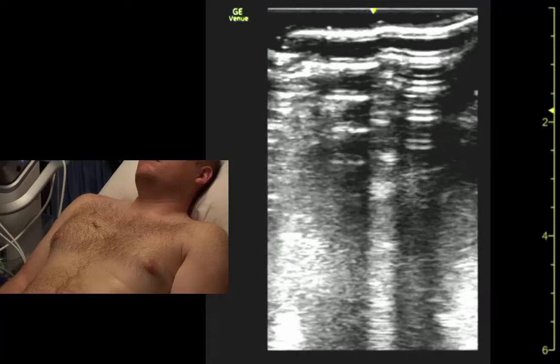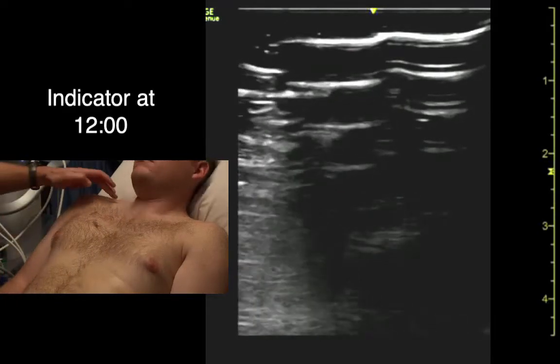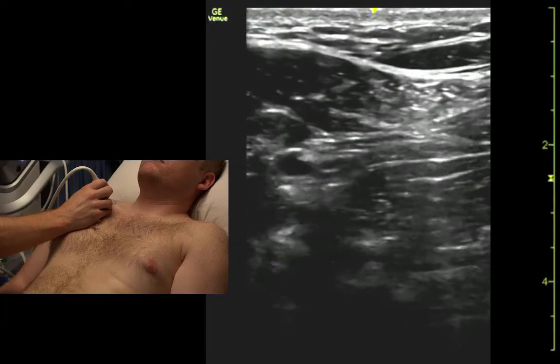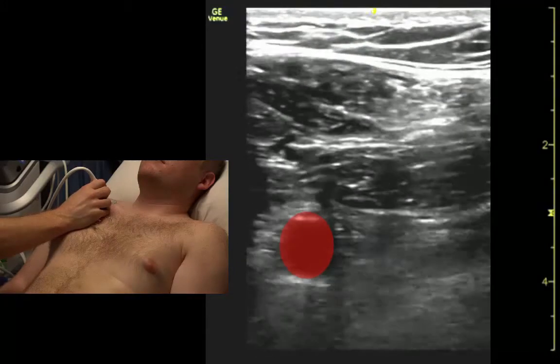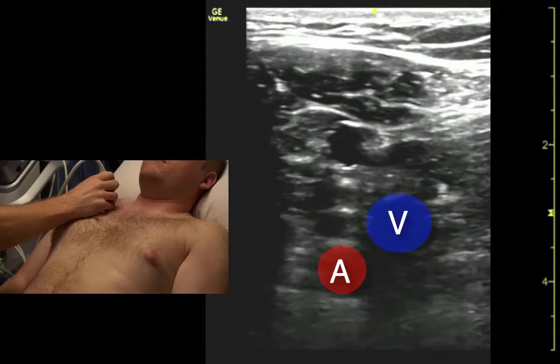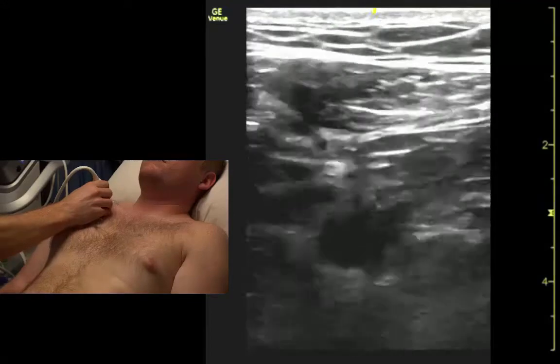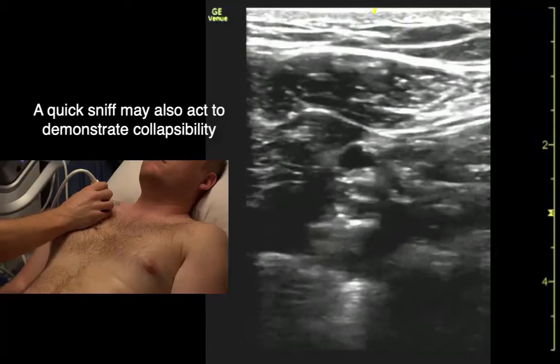I'm going to come out of chest mode for a minute to look at subclavian vessels. If we're looking for upper extremity DVT, we come up with the linear probe right on the clavicle, find the clavicle, slide just below it, and then we can see the subclavian artery pulsing. If I ask him to Valsalva — big breath and hold — now we can see the subclavian vein. And we can even compress it a little bit. That's it down there next to the artery. If it's spontaneously collapsed, there's no clot in it.